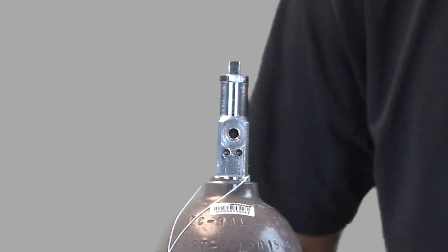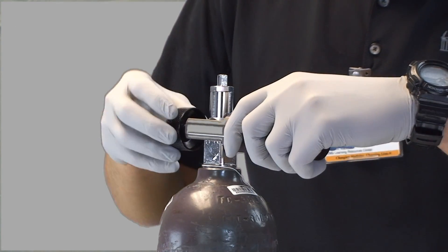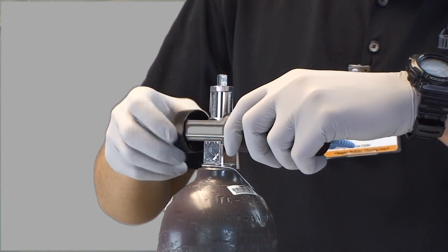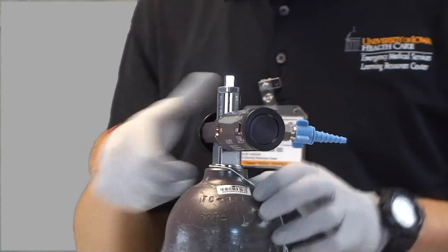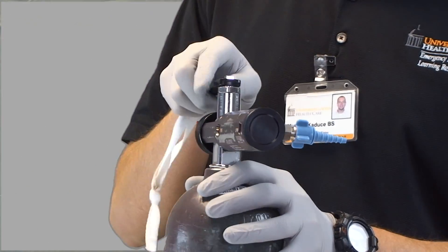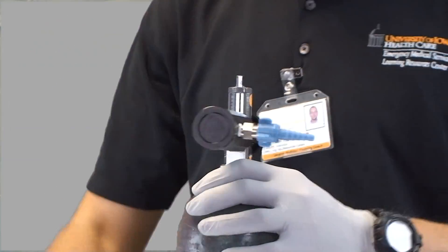Next, I will assemble the tank and regulator. I will place the regulator on the tank, ensuring the presence of an O-ring and alignment of the pins. I will turn the wrench one full turn counterclockwise to open the oxygen valve, then state the pressure by reading the pressure gauge on the regulator.